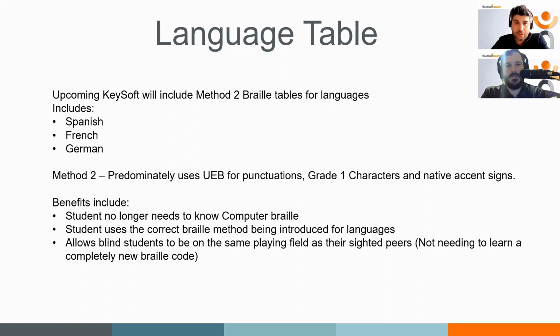Thanks, Peter. Another question, is there a list of how the BrailleNote Touch shows layout features, for example, paragraph, center, etc.? I believe there is a guide that explains some of the formatting. So, you know, how to center a line, or how to create bold, or how to do italic, or other format parts of your document, maybe heading styles, for example. So there are some useful guides on how to tackle that. Again, all in our HumanWare Buddy application under the word processor category.